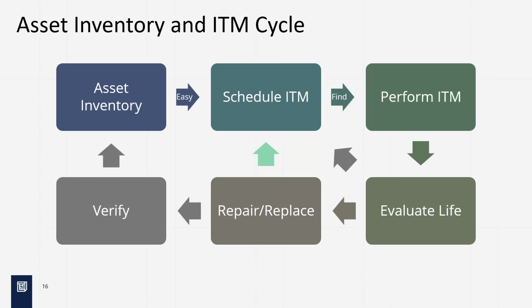You try to keep everything all nice and neat in January, February, March, but over time, with delays, with finding it, you're really required, when is it out of compliance? It's from the last time it passed the inspection. If it's a year from when it passed the inspection, you have a year until the next time. Well, the one that passed inspection 3 months ago is going to be due 3 months before the one that you just got back from the vendor and they repaired it.